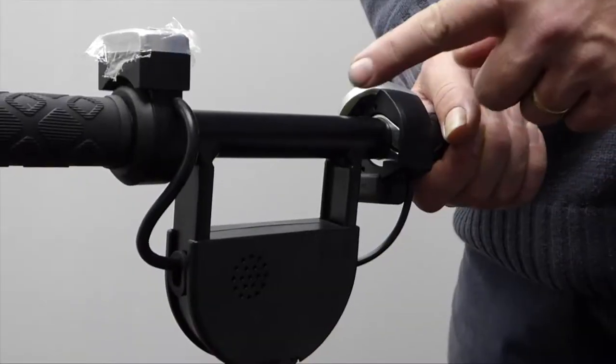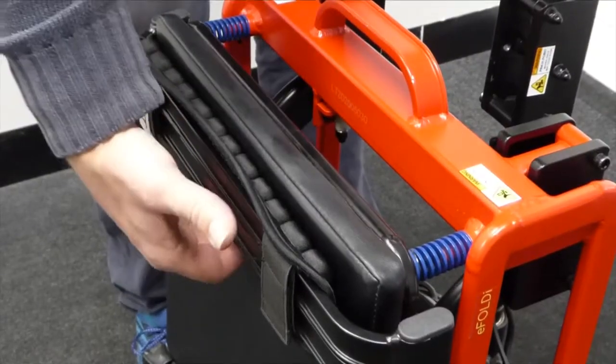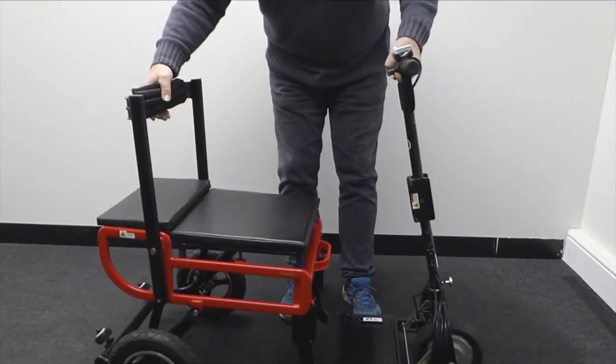With one hand grip the centre of the steering tiller, with your other hand grip the backrest, and now simply pull the scooter apart with a firm action.